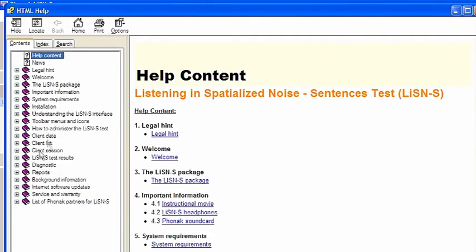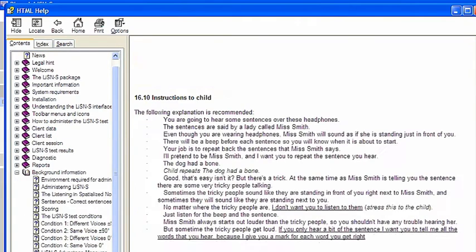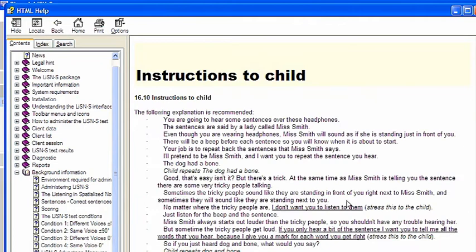In each of the four test conditions, testing ceases automatically after between 22 and 30 sentences.